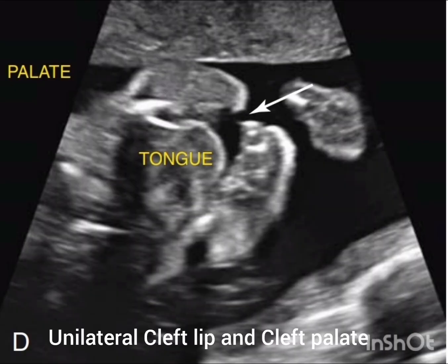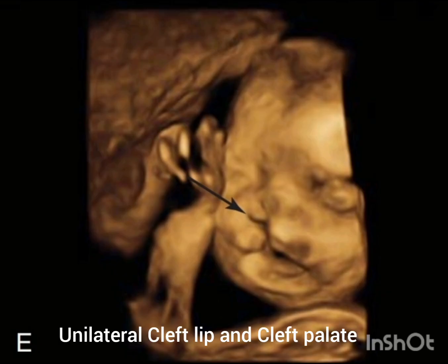The axial image of the same fetus reveals the defect extending through the palate, indicated by the long arrow. The 3D ultrasound of the same fetus confirms the finding. You can see a large defect in the face due to involvement of both the upper lip and the palate.